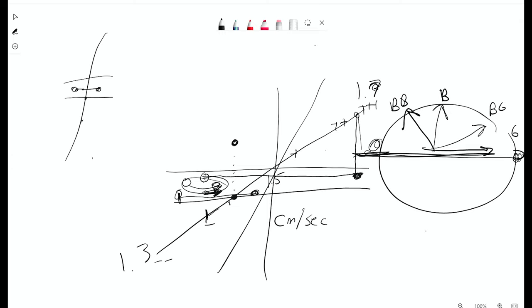Right, right. And so that's what we do in MRVs, and I challenge everybody to do a phase contrast MRV. It's really good. Right. So you can sit there and say, I want to be sensitive. So I'm going to have my superior sagittal sinus, transverse sinuses coming down to the jugulars. I am going to do one of these to go from A to P, one of them to go from head to foot, and one of them to go from right to left. And then I'm going to sum them all together. We call it the magnitude sum.